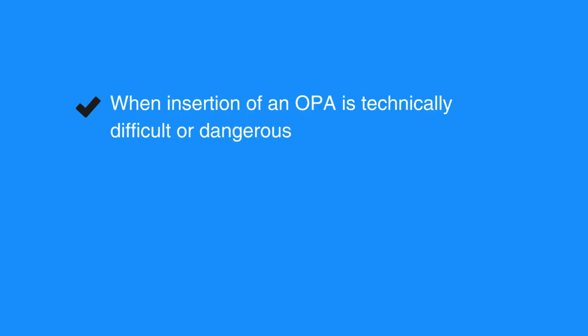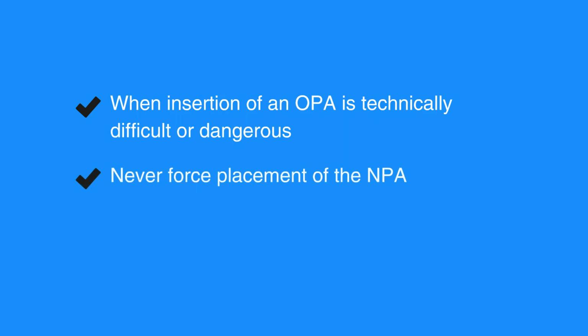NPA placement can be facilitated by the use of a lubricant. Never force placement of the NPA, as severe nosebleeds may occur. If it does not fit in one naris, try the other side. Use caution or avoid placing NPAs in individuals with obvious facial fractures.